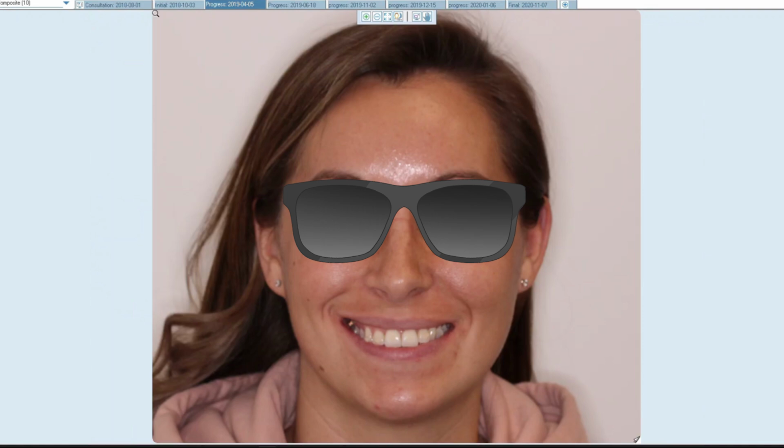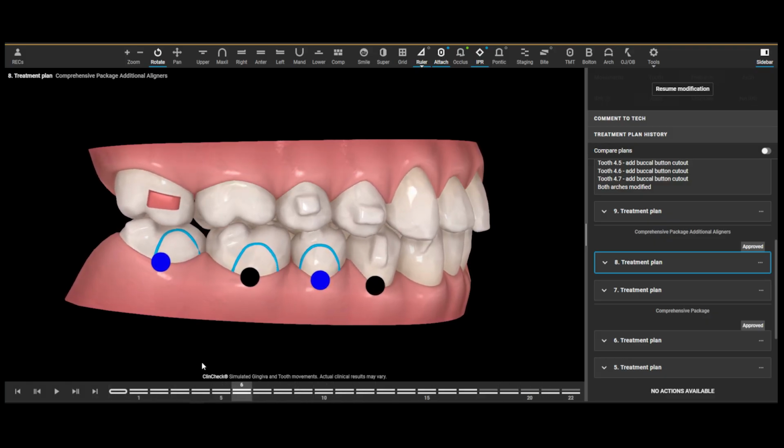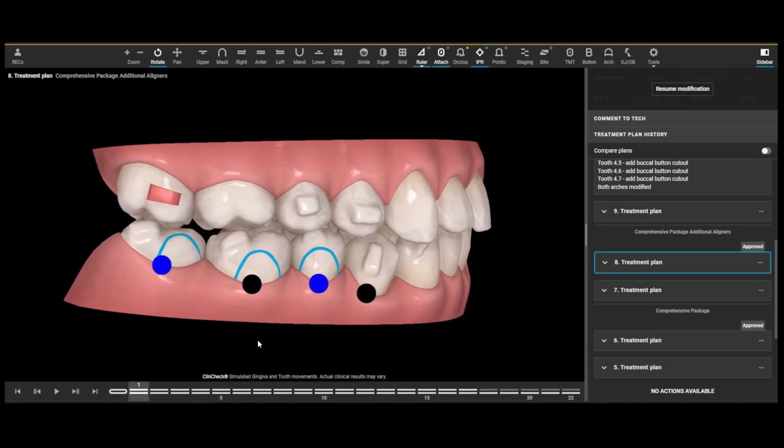Now we're at refinement. So what do we do at refinement? Well, it's pretty easy. All we're going to do at refinement is go ahead and get more trays that are going to push those teeth up. So here's treatment plan number 8. We've got some extrusion occurring on those lower premolars and molars.